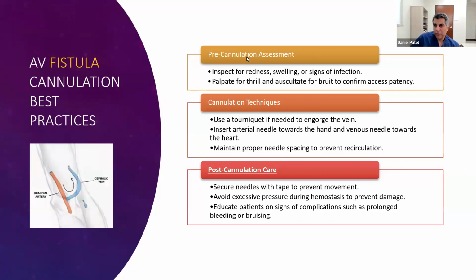For fistulas, what are our best practices for cannulation? Your pre-cannulation inspection of the access, just looking with your eyes and feeling the access, looking for any redness, ulcerations like we just saw, any signs of infection.